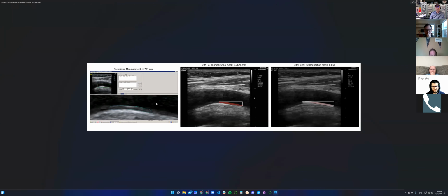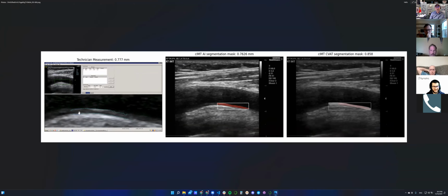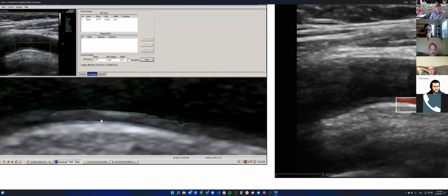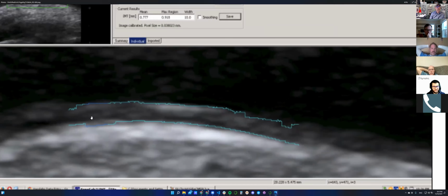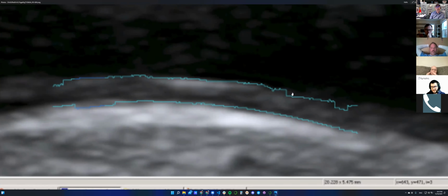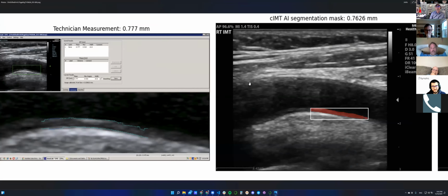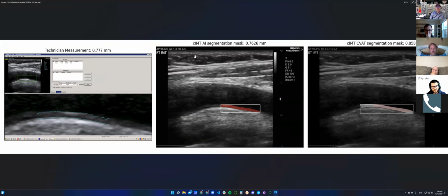Yeah, I think, Rich, you can share those figures with Joe. We have those uploaded, so you can have a more detailed look. And in a lot of cases, as Jonathan mentioned, if we can see this shape right here, I see a gray area, right? So it's most likely IMT. But if this area is not drawn, this surely affects the average measurement. And if we see the average measurement, in that case, it's pretty close.